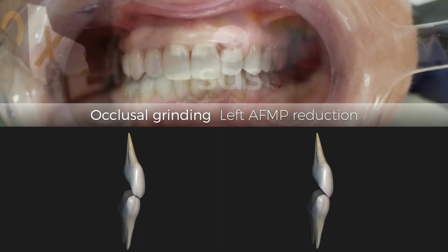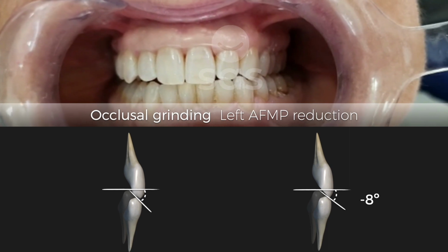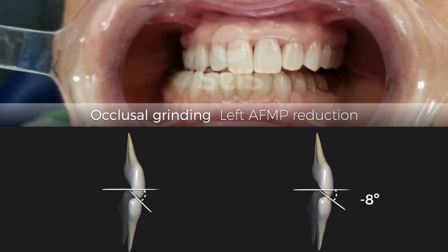In the video, you can see how we reduce the left masticatory angle. Now it's easier for the patient to guide her mandible to the left side, because the effort it takes to move to the left is less than to the right side. With these adjustments and some practice, the function will be well balanced.